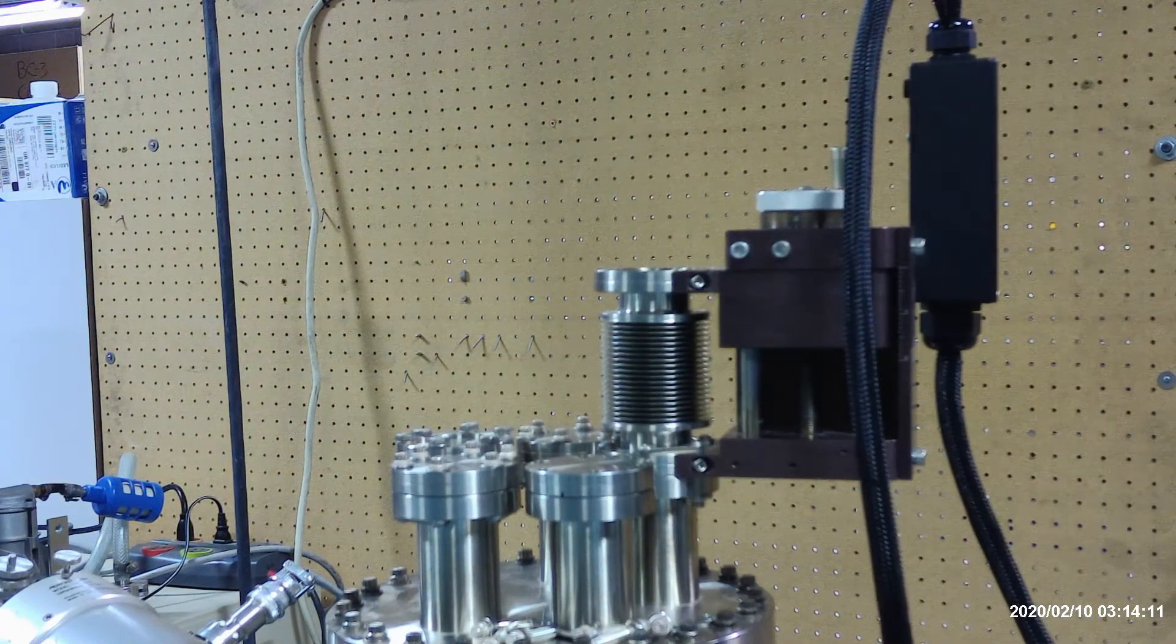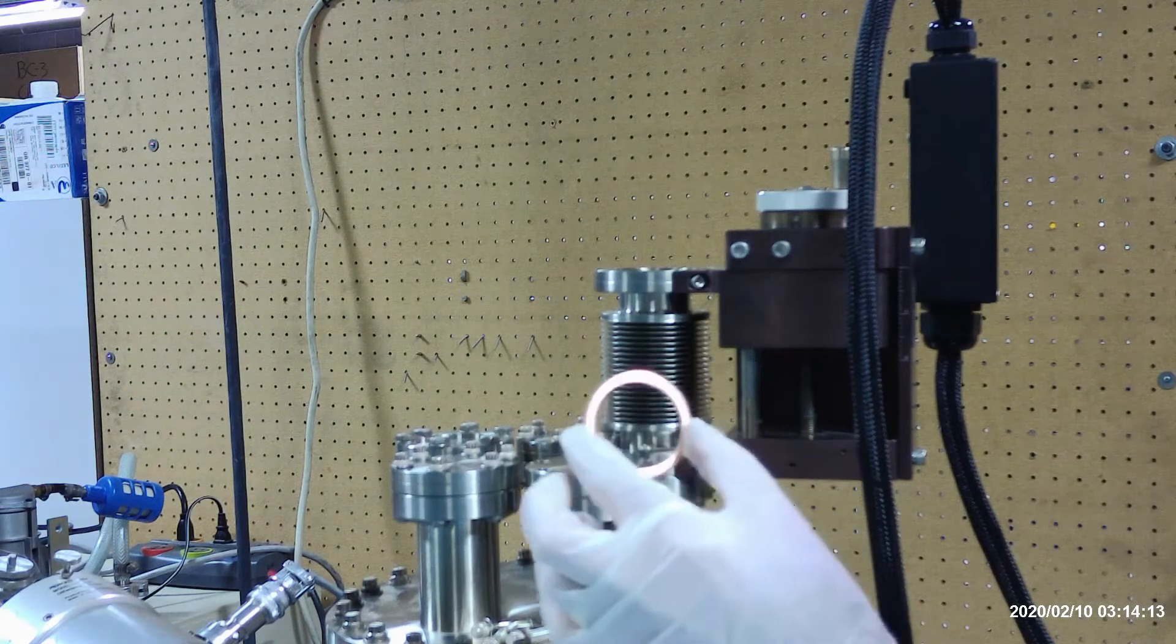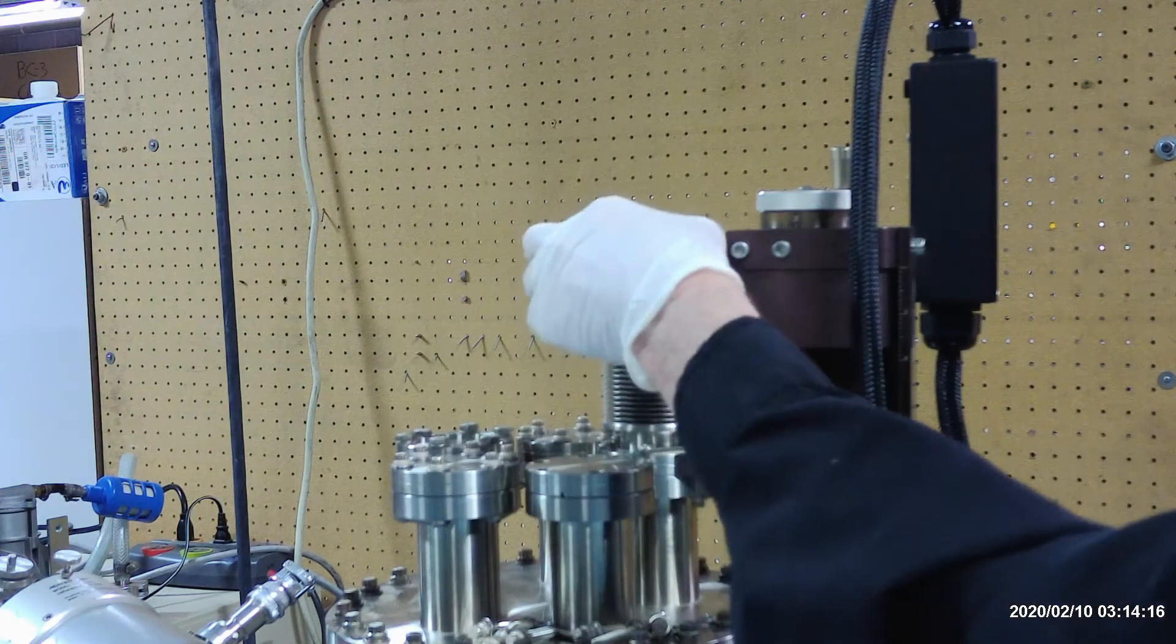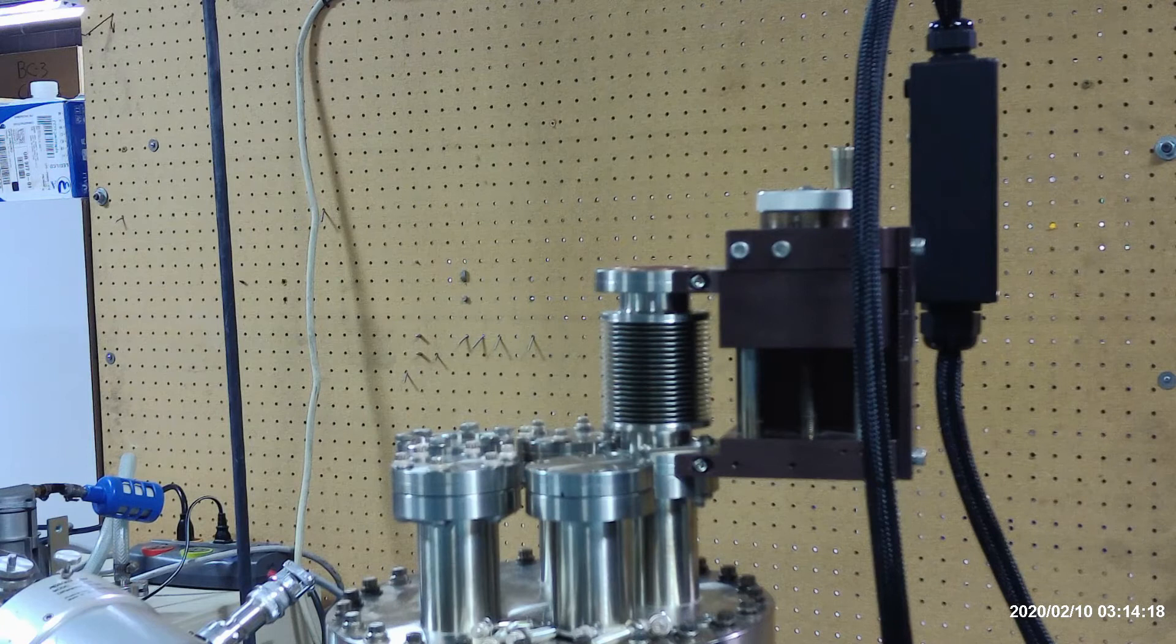We will get a gasket ready, a large ID, 2.75 OD flange gasket. It's got 1.52 inch ID for more clearance.